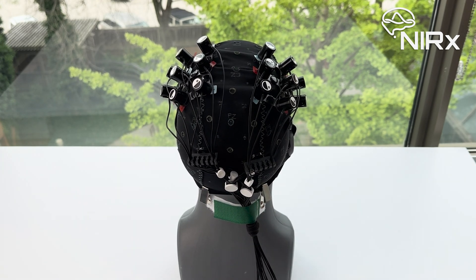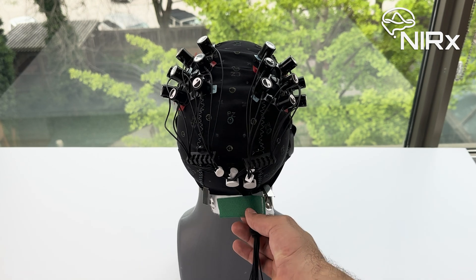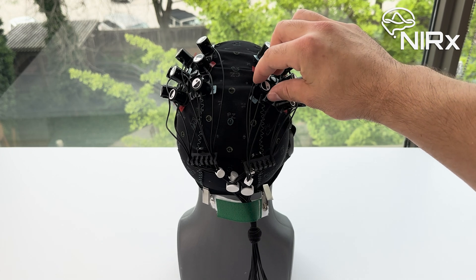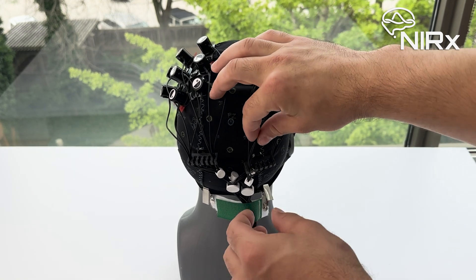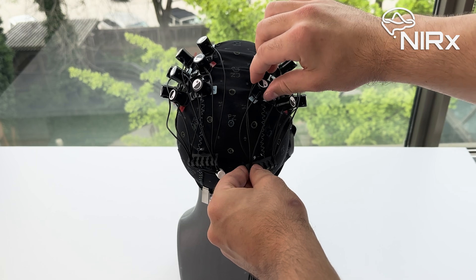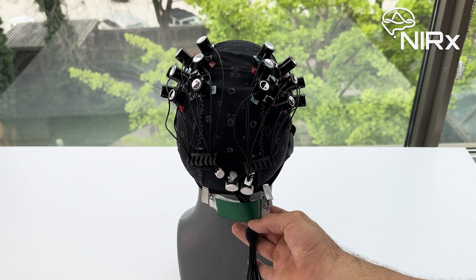To check if your cable management successfully withstands moderate cable movement, tilt the green velcro clip up and down. If enough slack is provided, there may be movement in the wires below the cable tree. However, the positions of the optodes should remain stable throughout the movement. To correct any moving optodes, add more slack and retest.